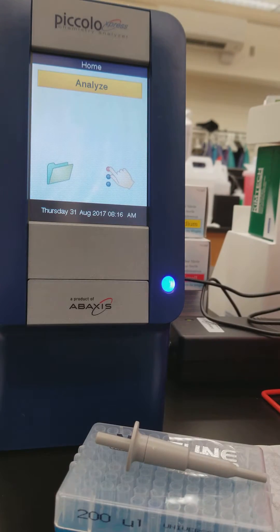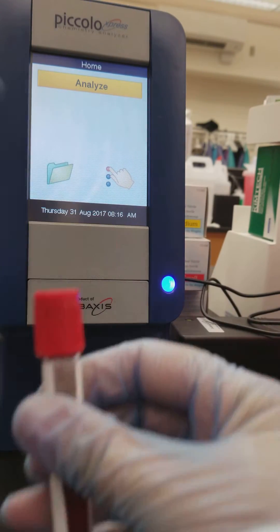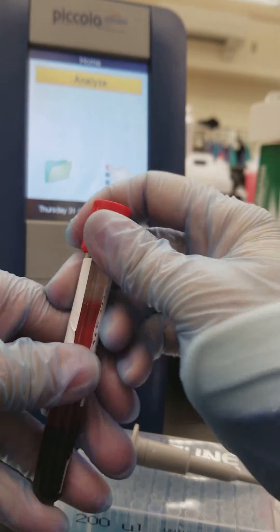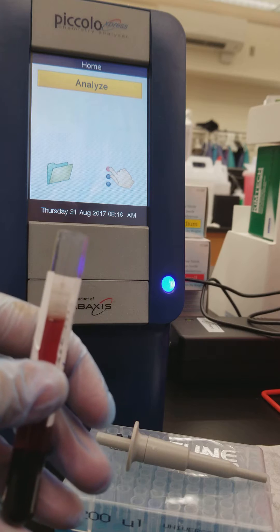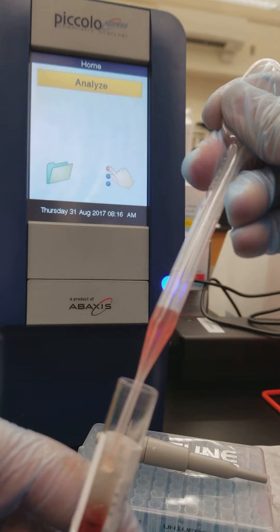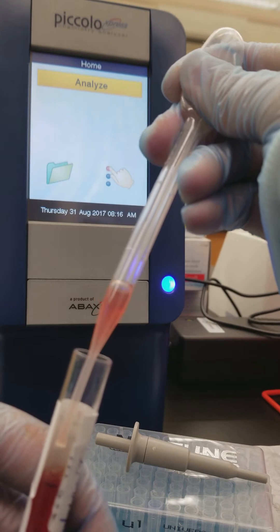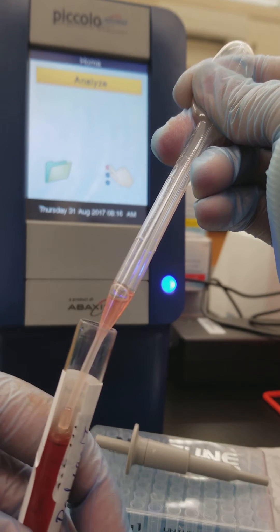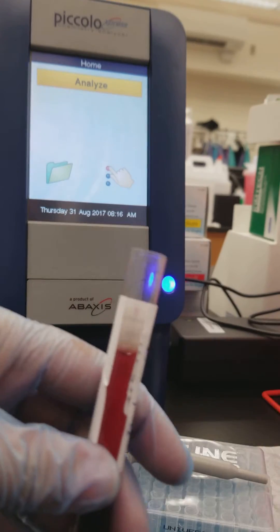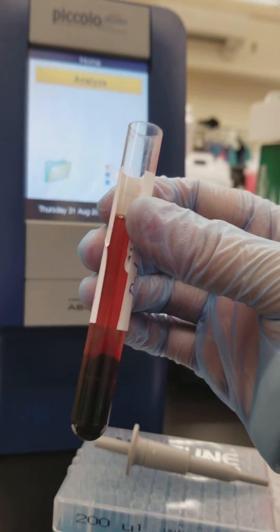We are going to be using a red top today. It does look a little bit hemolyzed, so before we run it we are going to pull it up out of the tube to make sure it truly is hemolyzed — and yes, it's slightly hemolyzed, so we'll still run it because that's okay. We can just make a comment in the LIS that it is hemolyzed.